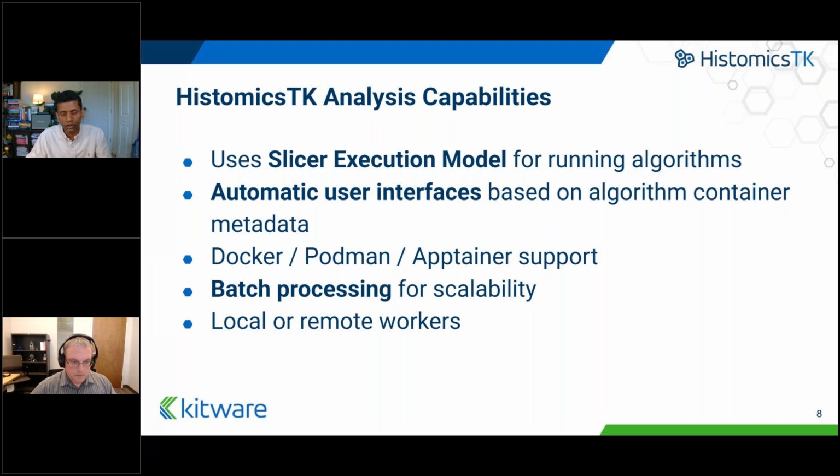While we default to Docker, we support Podman, a preference for your organization's security requirements. When you're experimenting, it's useful to run algorithms on individual slides or just a region of interest. Once you are ready, you can scale up to batches of images. Algorithms can run locally on a laptop or on remote workers that scale as needed.